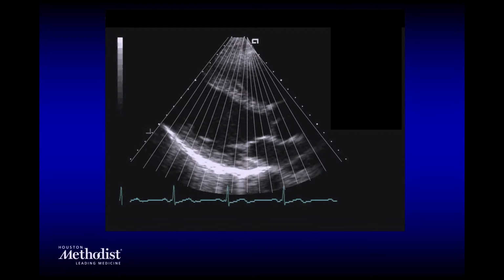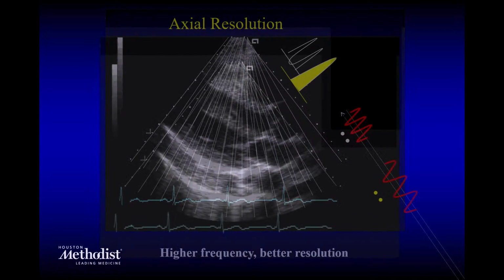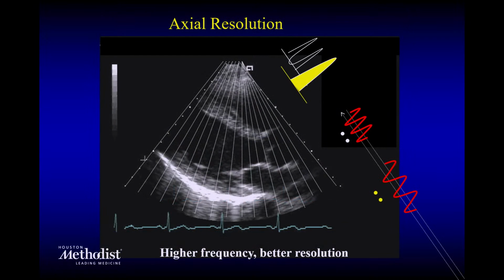As you could see, we emanate from one place here, because you have to go between the ribs for you to be able to see the heart. So the spacing of these small beams is larger further away, which adds to the lower resolution, going forward down the line.